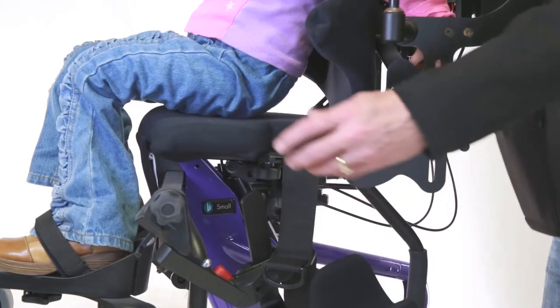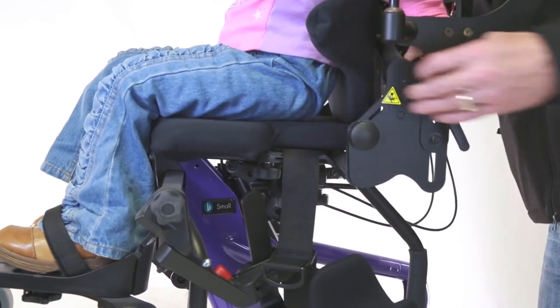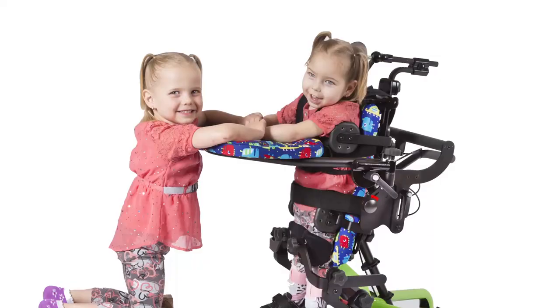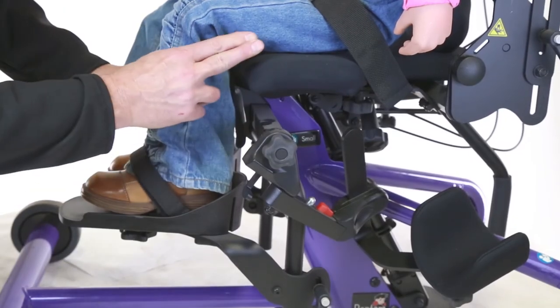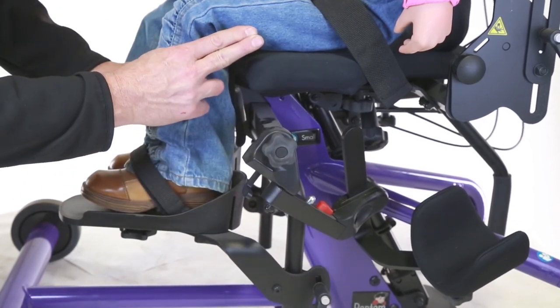Step 5: Get the Hips Back. Make sure that the child's hips are as far back as possible. Using a hip positioning belt may aid in positioning. Keeping the child's hips in line with the Bantam's hip pivot point will help bring shear to a minimum. One way to determine correct positioning is to check the gap between the back of the knee and the seat — this space should be approximately the size of two fingers.